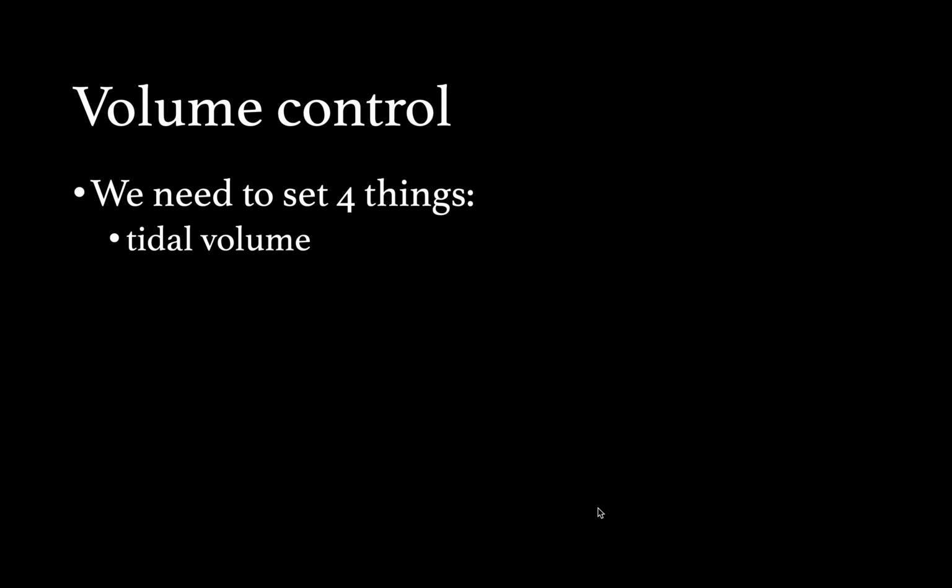We wanted to be able to execute these strategies using volume control. And we considered 4 parameters which were in our control. They were the tidal volume, the respiratory rate, and also the IE ratio, the FiO2, and PEEP.